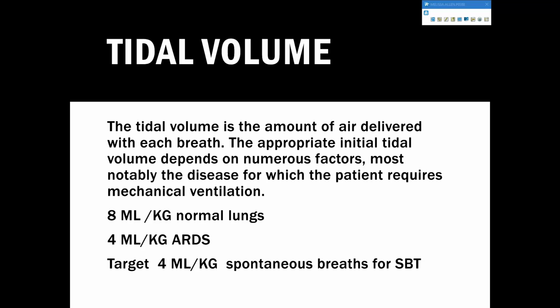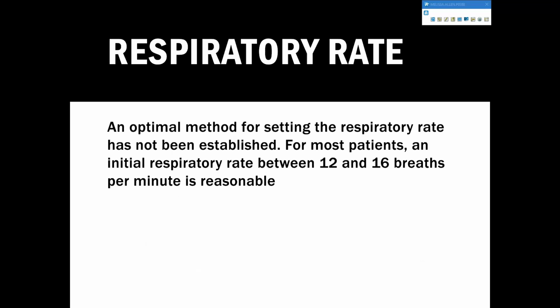So if we set that ventilator correctly and gave them 420, they only have to hit about 200, 210 if it's a tiny, tiny little old lady. That's their 4 mLs per kilo. Most of the time they'll do better than that, but they did not fail. If their set tidal volume is 400, that is 8 mLs per kilo, and they're only drawing 200 on spontaneous, no, that's not a failure. If it's a much bigger person, then that is. So it's all specific to the individual.